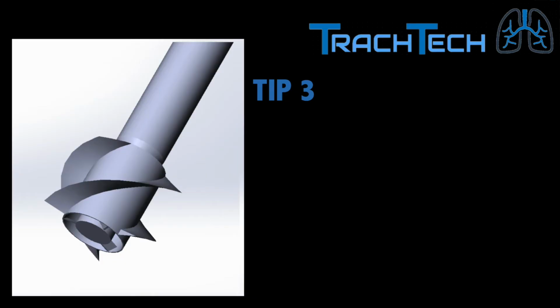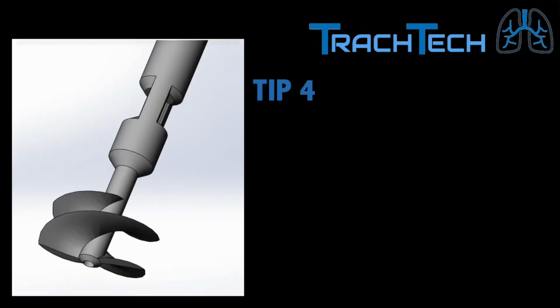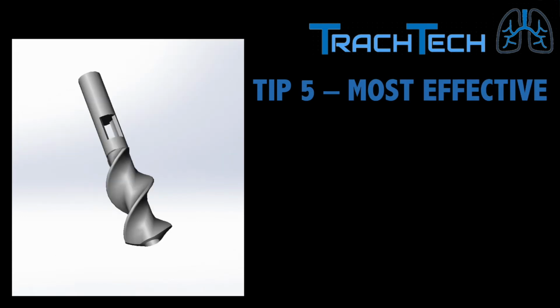Tip 3 snapped in half a few inches inside the tube on its first trial. Since we only had one printed version of Tip 3, we were unable to test it further. Tip 4 had a removal percentage of 50% over 5 trials. Tip 5 had a removal percentage of 92%. It was by far the most effective design in terms of mass removal.